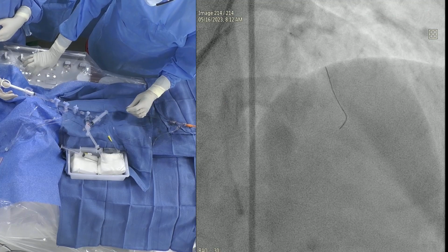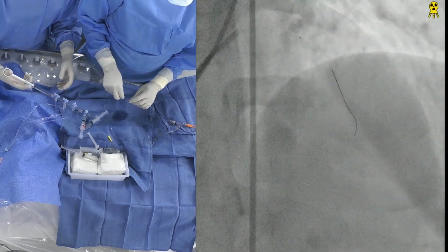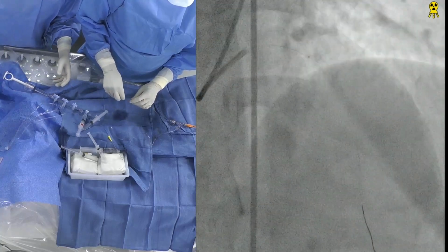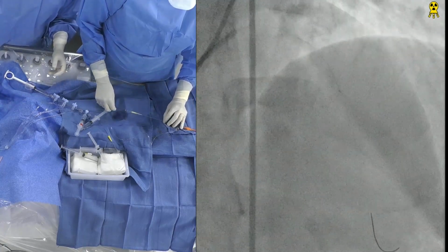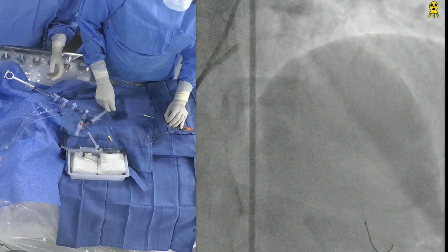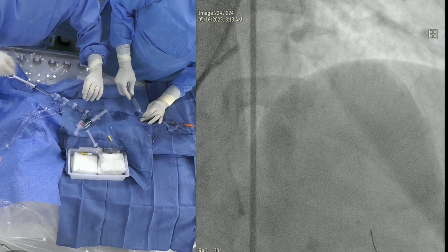But even with the guidelines, IVUS is no longer a determinant for lesion significance based on the MLD, because trials never prospectively looked into it, while IFR and FFR had a lot of prospective trials to establish the validity of correlation of abnormal IFR and FFR with subsequent outcome.